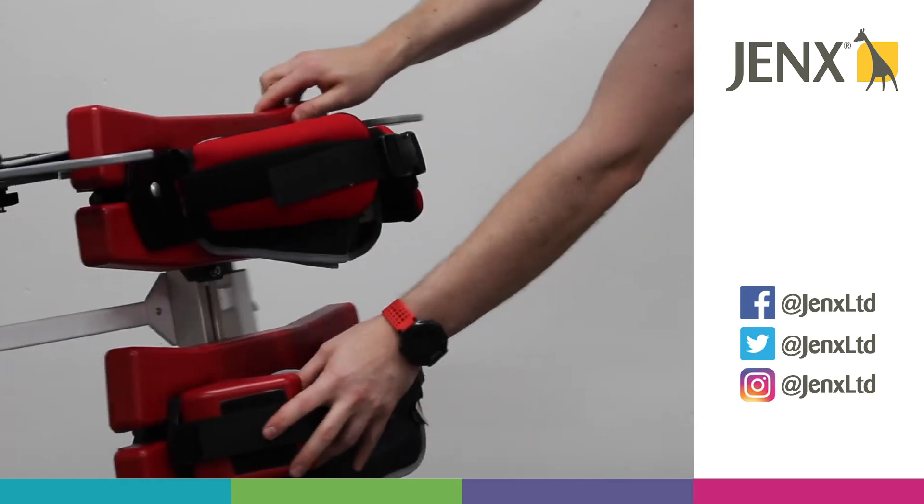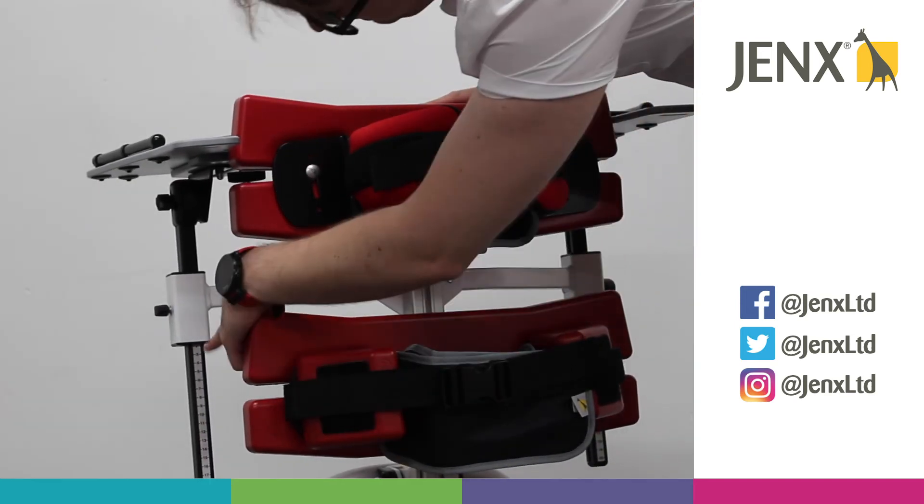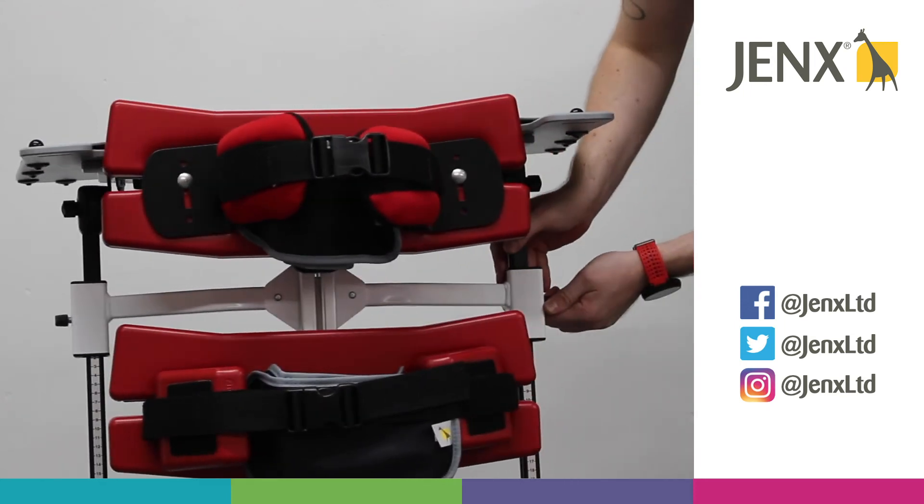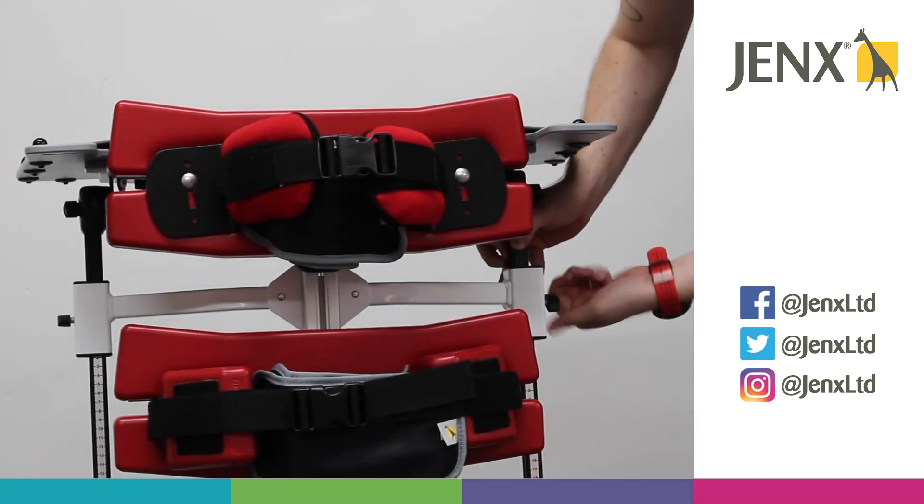You'll also notice on the tray arms that we have a set of numbers, so that way you can ensure that the tray is at the correct height on both sides.